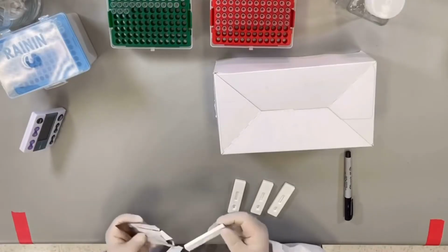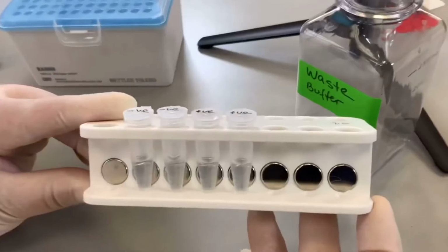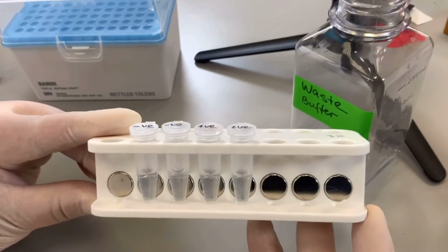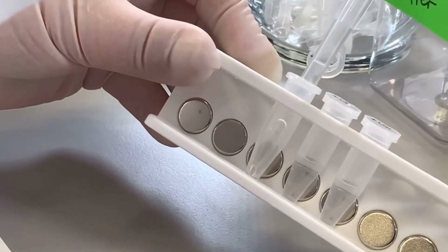Open and label the cassettes. The cassettes should be removed from the fridge 40 to 60 minutes before the start to allow them to come to room temperature. After 30 minutes on the magnetic rack, you will see the nanoparticles accumulate and form a tiny dot. Remove the liquid gently from the first vial with a pipette.